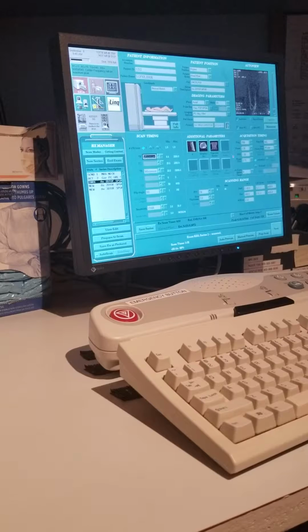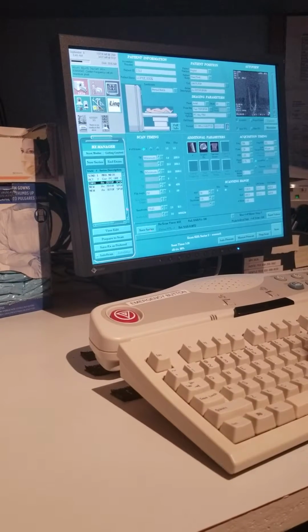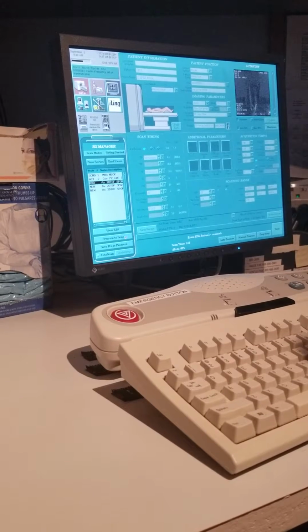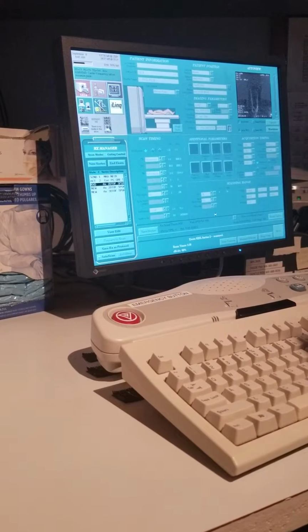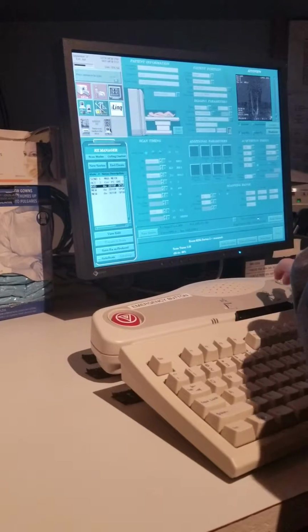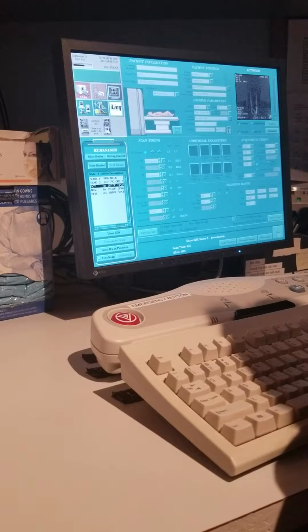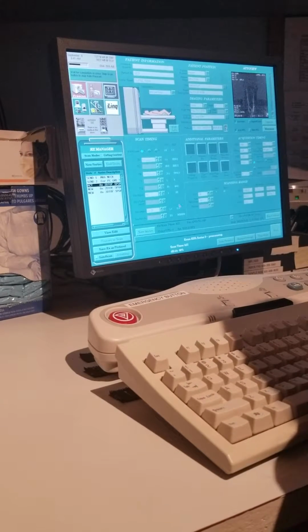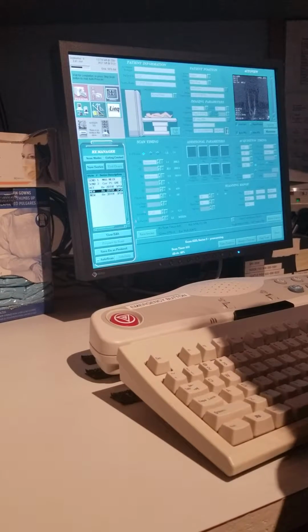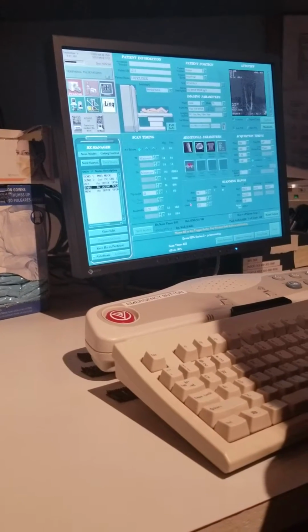Okay. So are we good? Yes. Wow, it's still 5 minutes long. Yeah. I'm not sure what the next 2D time of flight is. Go ahead and open it. So it's just a repeat.